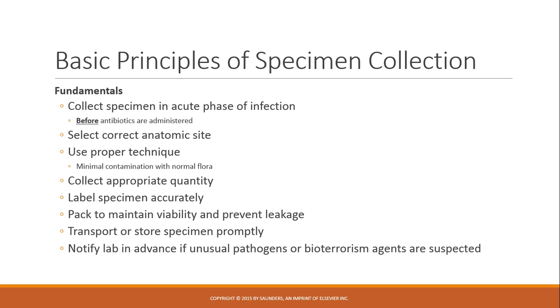Because we are dealing with infectious processes, we need to collect the sample before antibiotics are given to the patient. Those antibiotics can potentially affect if we are able to isolate a pathogen or not. They could even, in the case of blood cultures, if the patient's given intravenous antibiotics, the antibiotics could be in the blood that we collect, and that could inhibit the organisms from growing in the blood cultures. And so we'd get a false negative result because antibiotics were started too soon.